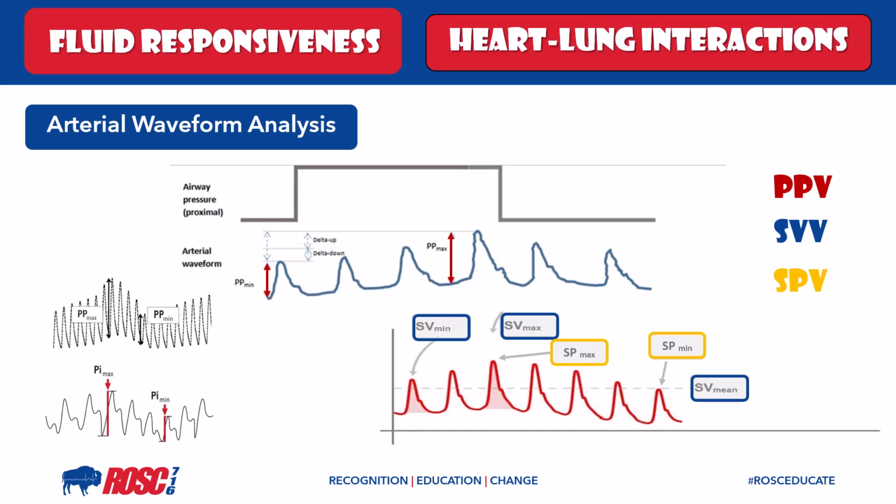The last thing that I like to point out is the same variability that we see on a pulse ox. This is the Pleth Variability Index. And while its use has already been incorporated into mainstream use, its validity is somewhat in question. It seems most accurate in an OR setting. This obviously limits our use and reliability of this test at bedside.